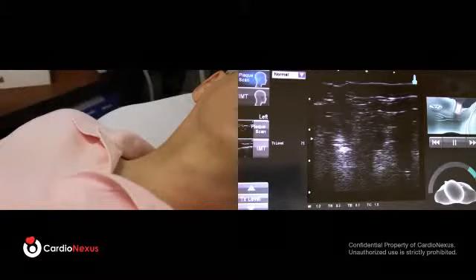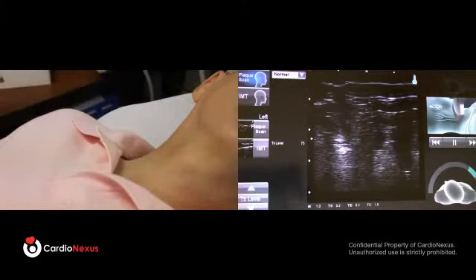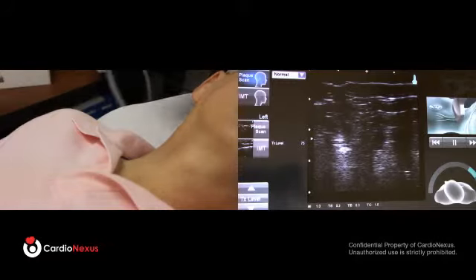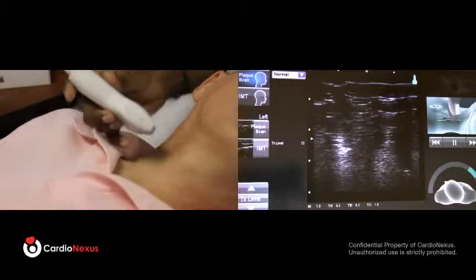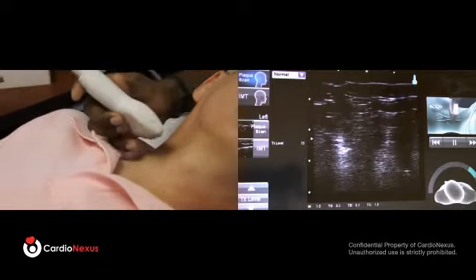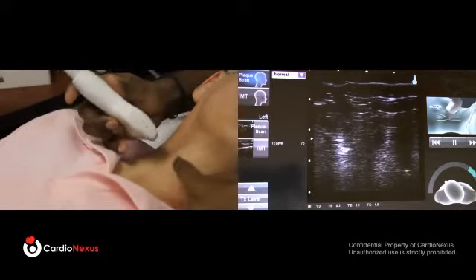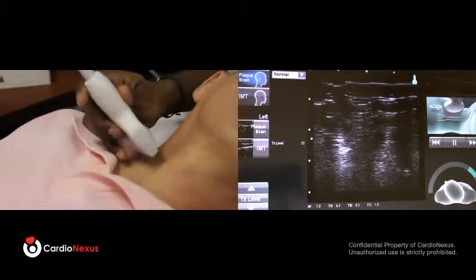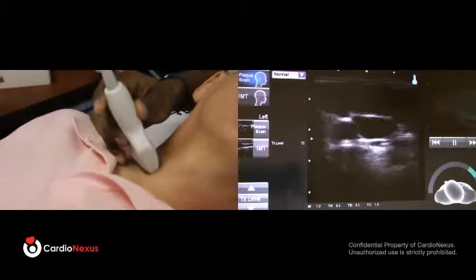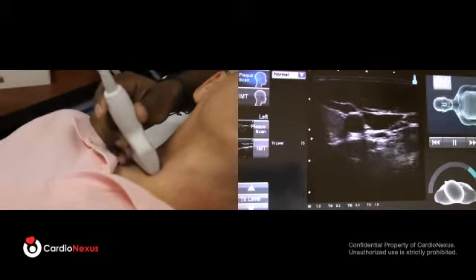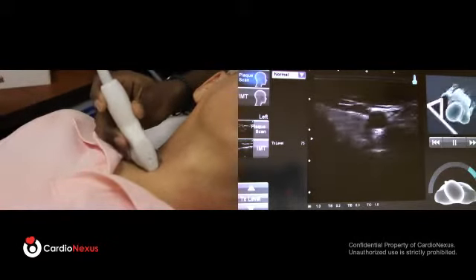We've repositioned the patient, moved the angle pillow to his left side, so we're scanning on his right side. To locate a cross-sectional view of the artery, set the probe next to the center line of the artery, next to the thyroid cartilage, and lay the probe flat.